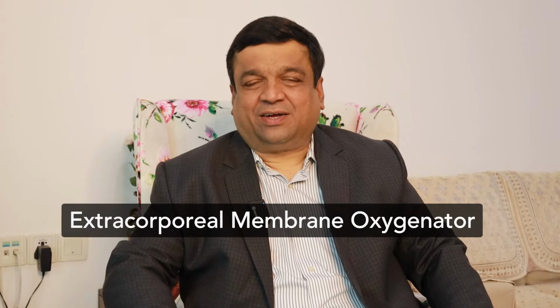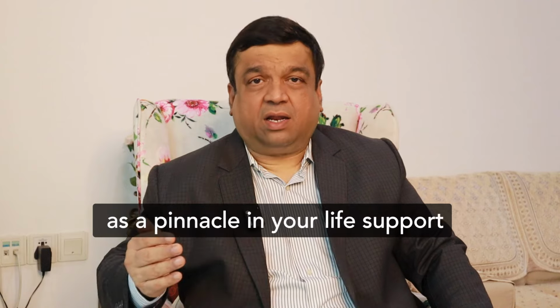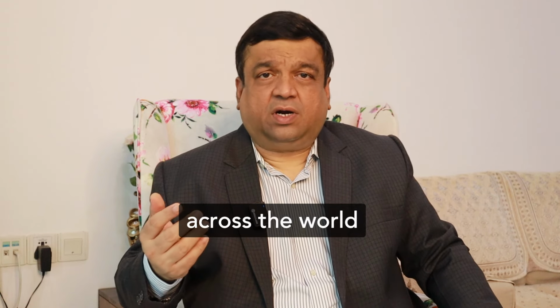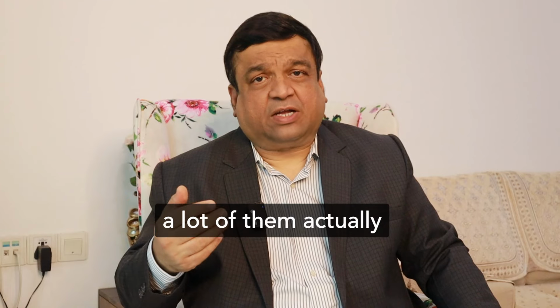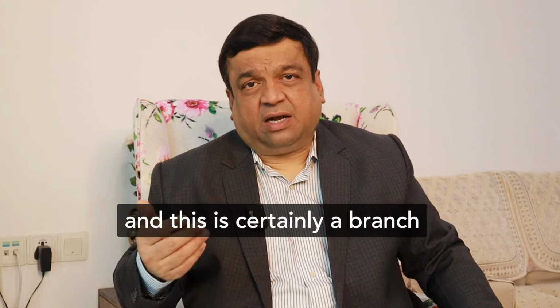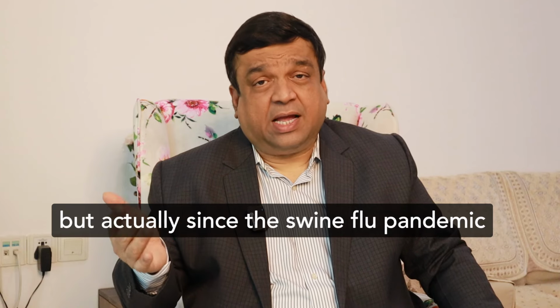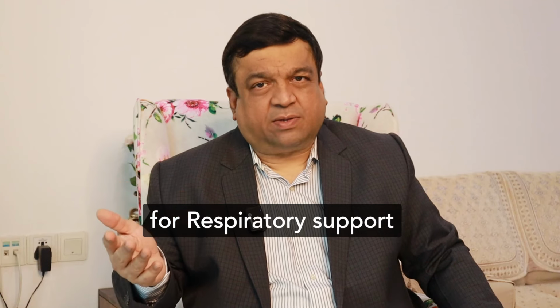Extracorporeal Membrane Oxygenator, or ECMO, is considered the pinnacle of life support in critically ill patients. A lot of intensivists across the world are trained in giving ECMO therapy. A lot of them are striving hard to become ECMO specialists. And this is certainly a branch which has revolutionized, I would say, not since COVID-19, but actually since the swine flu pandemic, especially the venous ECMO, which is used predominantly for respiratory support.